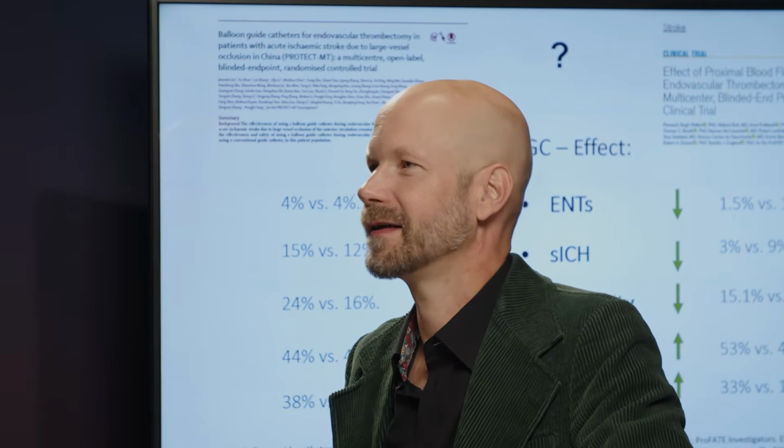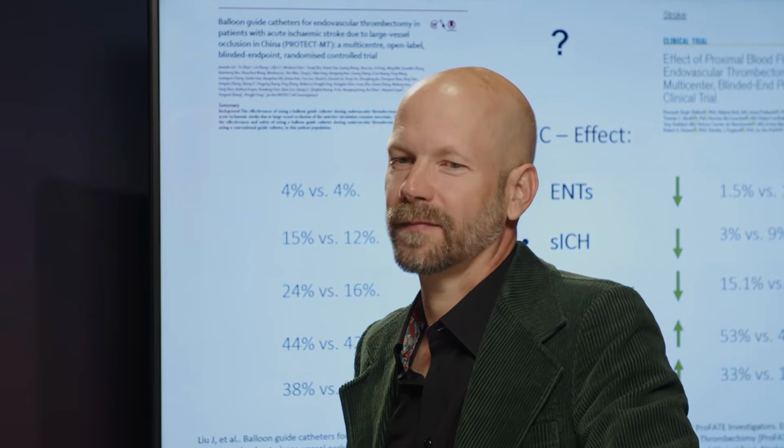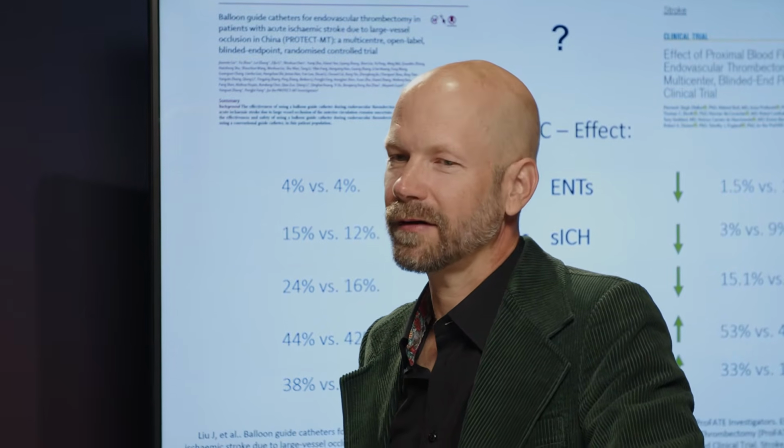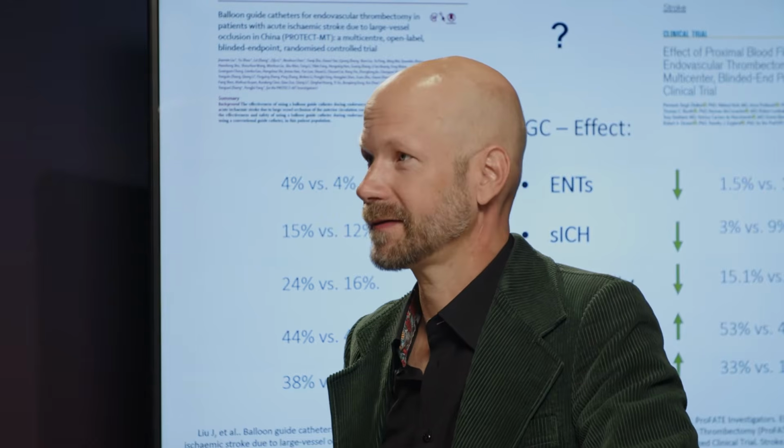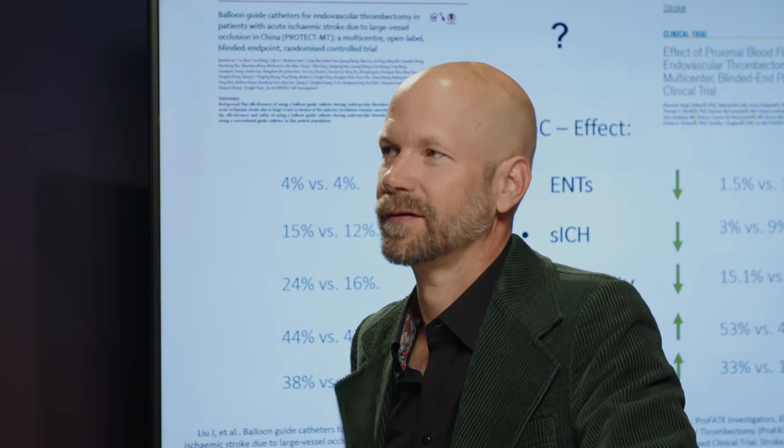Another thing is, of course, if you're used to using these kinds of devices, then you have a learning curve, like in everything. So do we have an indication that in the Chinese group, the physicians were not used to using a balloon guide, and that they had to do it in this trial? It is not published, so we cannot see it, also not in the supplemental material that we have. But they were experienced interventionalists. That is shown in the data. But not how many or how used they are to the balloon guiding catheters.